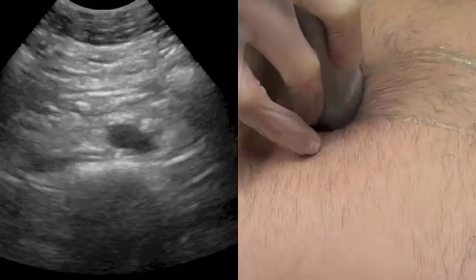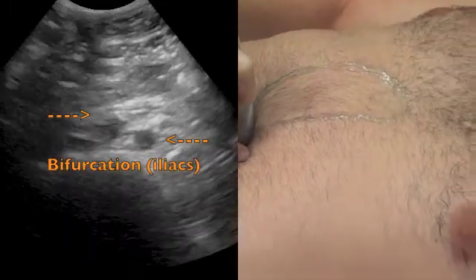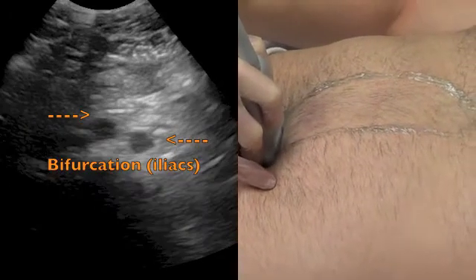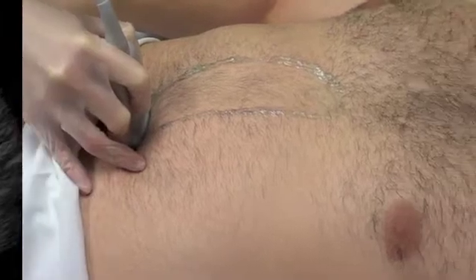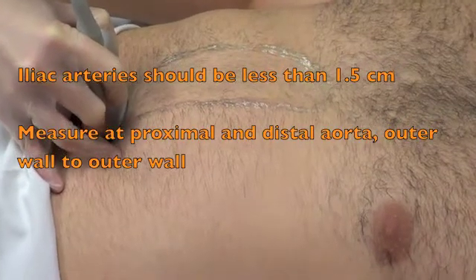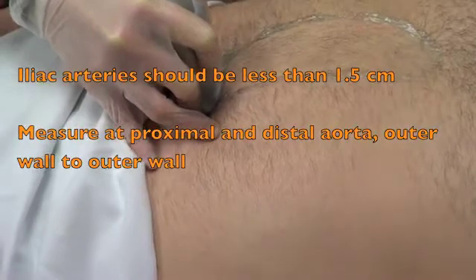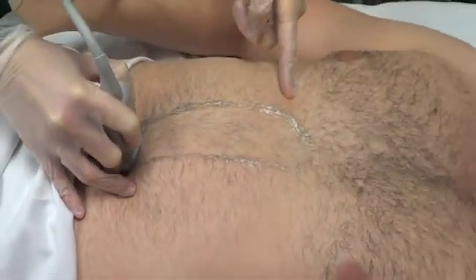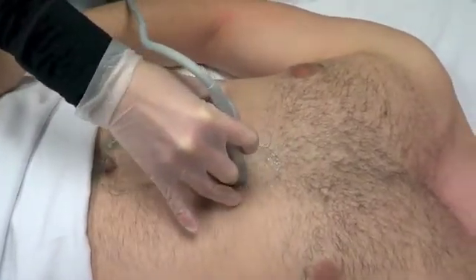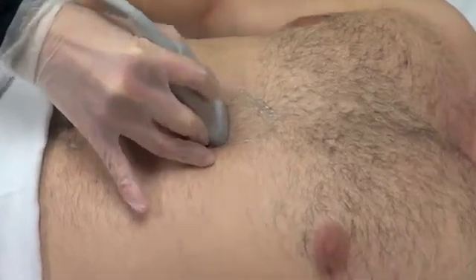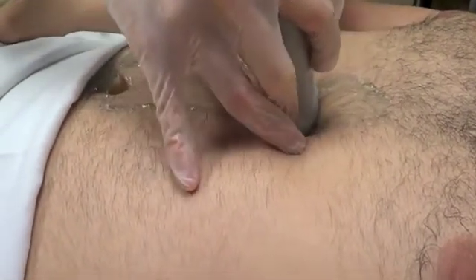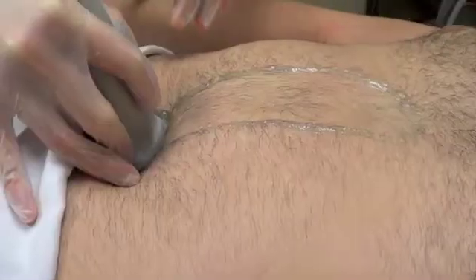You can continue down and follow it to the umbilicus, which is about where it's going to bifurcate, and you want to see the bifurcation. You want to visualize both of the common iliac arteries to make sure they look similar in size and that one's not larger than the other. Then you can take your measurements. You want to take typically one measurement proximally at the celiac axis if you're able to see that — sometimes you may have to tilt the probe upward. You may not get a great view until you look at the SMA. So you want to get celiac, SMA, and then as you go down, bifurcation.